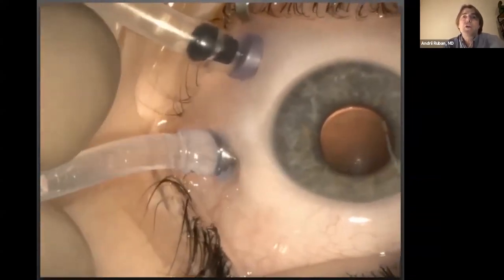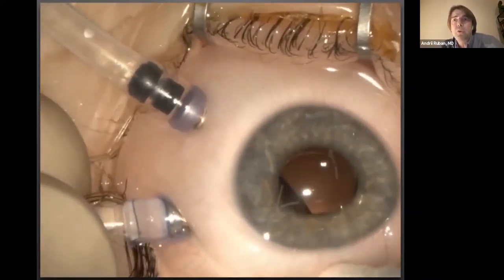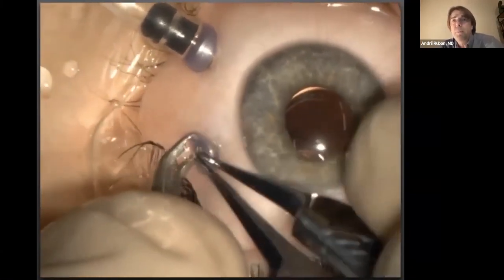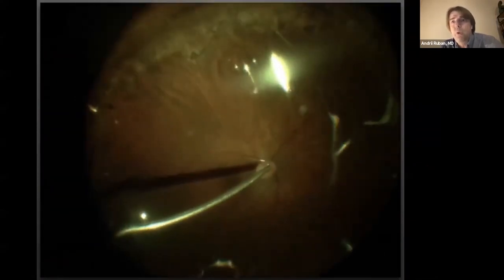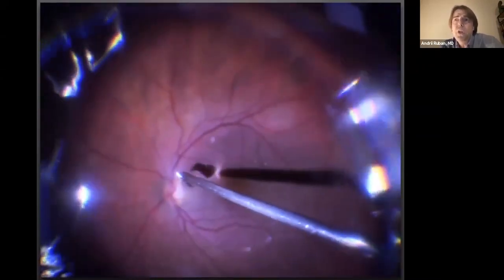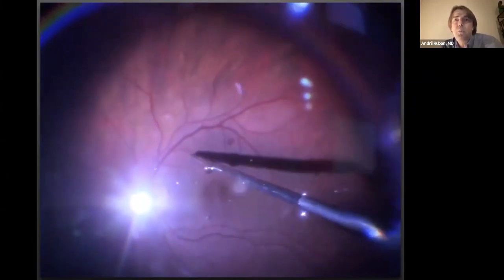I use high suction, which is applied through a cannula with a removable valve. This method allows me to maximally use the inner diameter of the cannula, which, according to Poiseuille's law, increases the flow rate. It is very effective even for silicone 5,000 centistokes. If emulsification is present, it is very difficult to remove all drops of silicone. For this reason, we have to perform liquid-air exchange several times and hold the vitrectomy probe at the level of the fluid-air interface. To avoid a hydro blow to the macula, I break the irrigation stream with the probe.